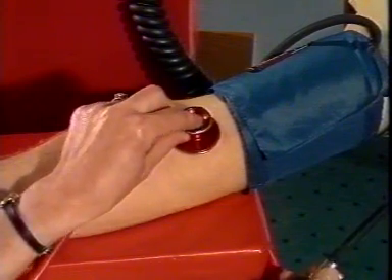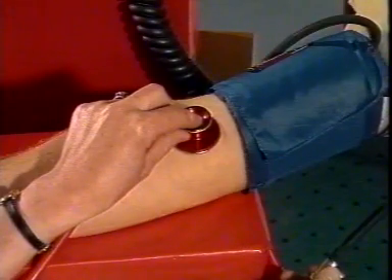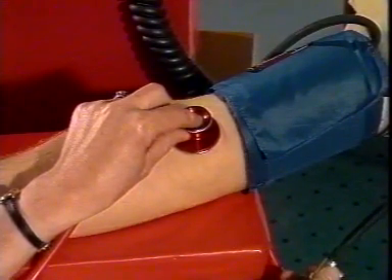The stethoscope is placed gently over the artery at the point of maximal pulsation. It must not be pressed too firmly or touch the cuff, or the diastolic pressure may be underestimated.